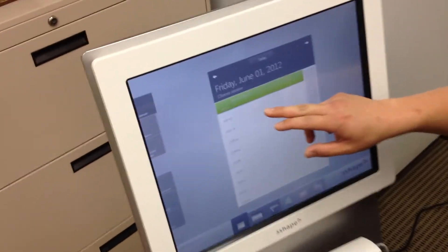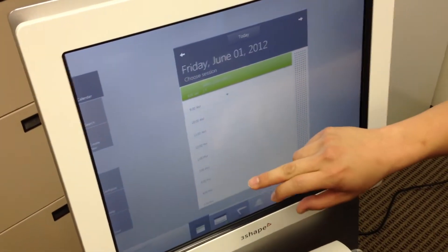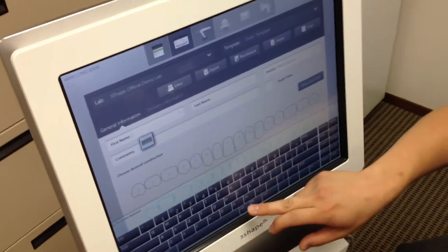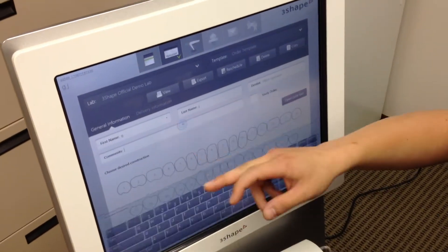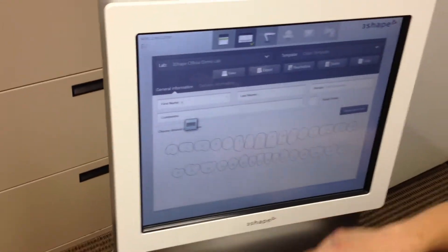Over here you can set your appointments. I'm just going to open up the 9 a.m. slot right over here. Let's go ahead and add in your patient name — I'm just going to add one-letter names. Any comments that you have, you can just go ahead and add that in there.